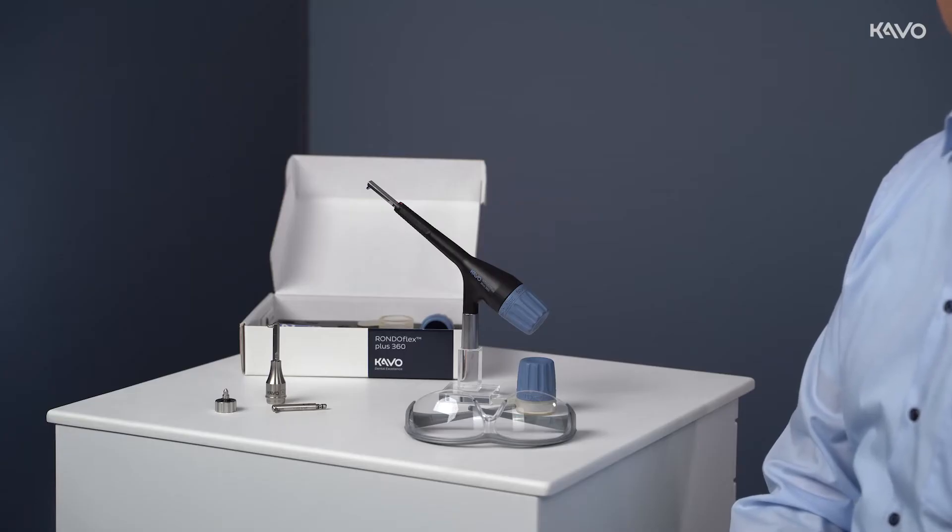Our product manager Andreas Tanner will guide you through the demonstration which shows the functional concept of the CAVO RONDOFLEX PLUS 360. No clinical training or clinical recommendation is given.